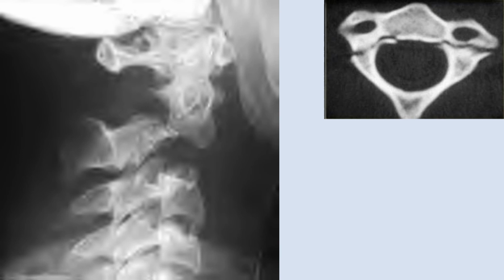The PT sent the patient back to the ER detailing his findings and asking for a flexion-extension X-ray to be done. It actually showed a hangman's fracture, a traumatic spondylolisthesis of C2 on 3, seen when in flexion the body of C2 moved forwards on 3. The images are not from the case, but they do illustrate the fracture.